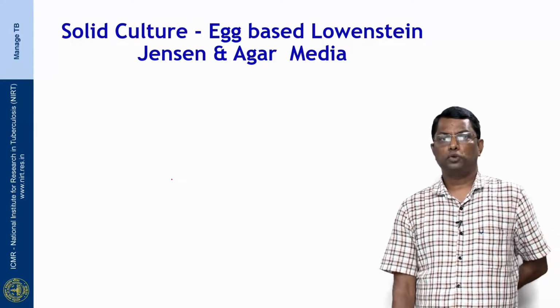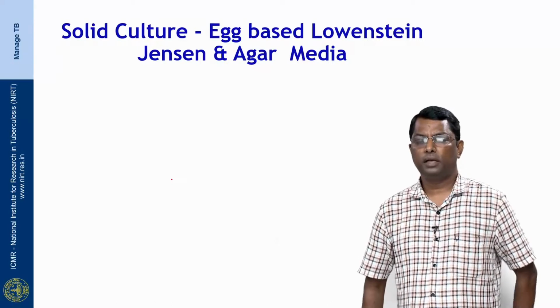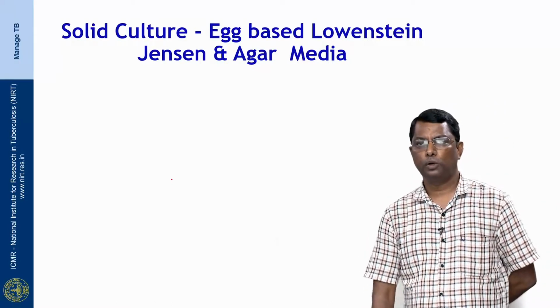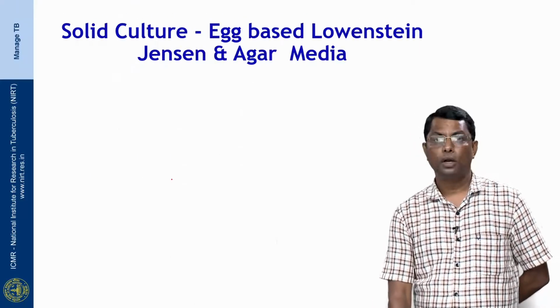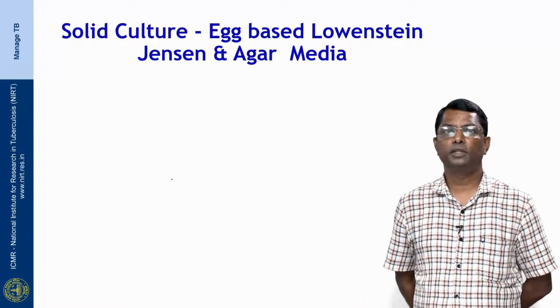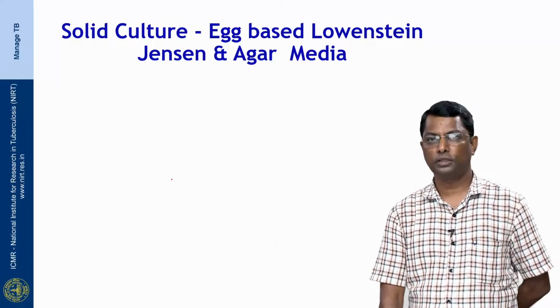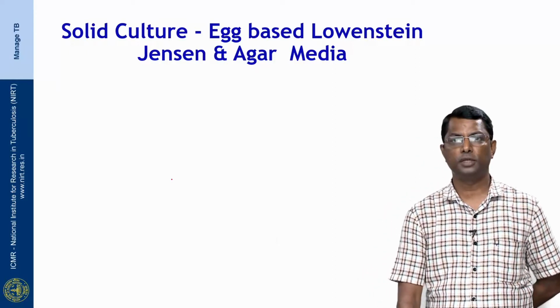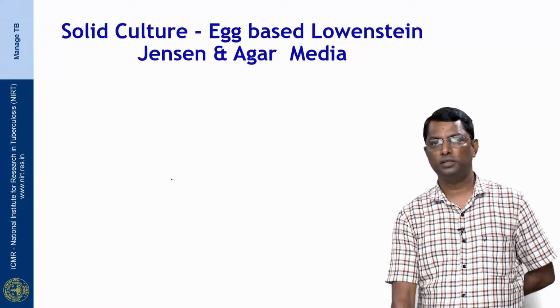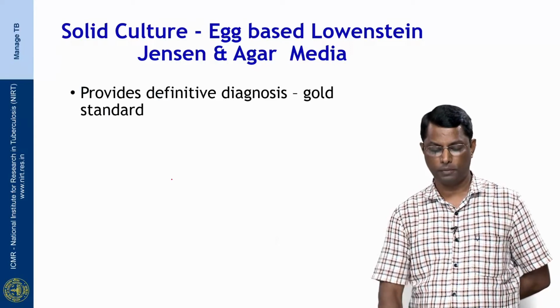Now, after microscopy, it's culture. First, we will deal with solid culture, and solid culture is mainly done on egg-based medium, and this medium is popularly known as Lowenstein Jensen medium. Now, moving on to culture-based methods. First, we will deal with solid cultures, and solid cultures are egg-based cultures, and there are some agar-based media as well. The popularly used LJ medium is egg based, and LJ is Lowenstein Jensen, the discoverers of the medium.